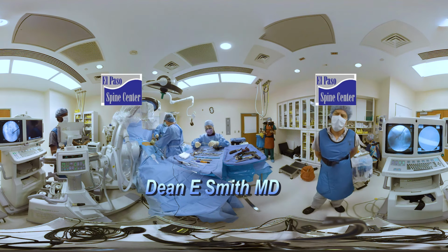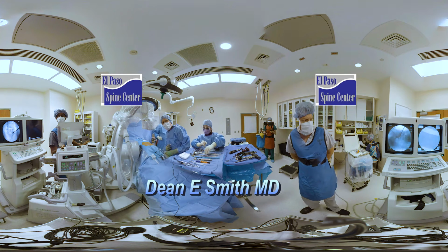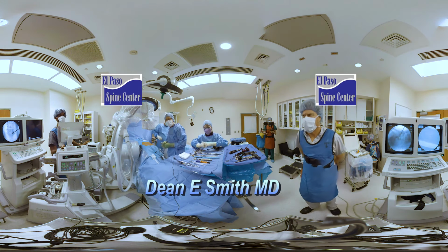Okay. I'm going to try to get it to go this way a little bit, maybe. Lateral. AP. It's almost in the middle.